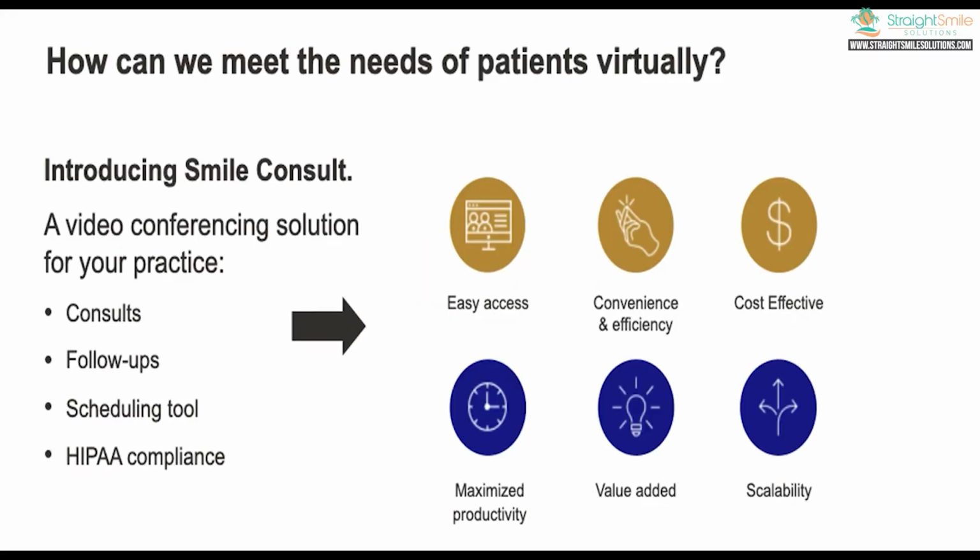Hi, this is Dr. Amanda with StraightSmile Solutions, and today we're going to be talking a little bit more about what Align Technology announced yesterday, which was their Smile Consult feature, as well as their virtual check-in feature. And the timing really couldn't be more ideal here. I've been nudging them for years to do this, as well as many other companies are doing it as well. But these are exclusively available only for Align Technology Invisalign patients.